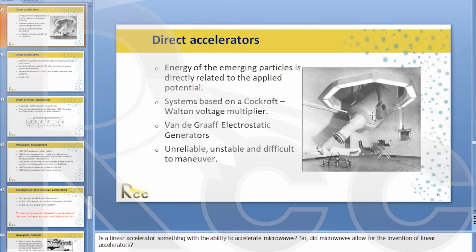All good questions. The half-life of Cobalt is about 5.3 years. And at least in the US, we would change the source after one half-life. So pretty much every 5 years, the source would get changed. Now, the problem, of course, with using a source beyond its half-life is that the treatment times get longer and longer and longer.